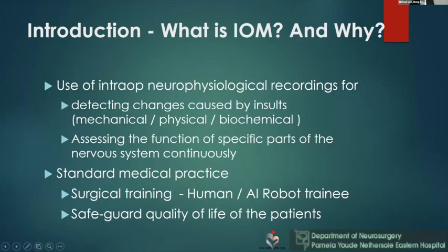So what is IOM and why do we do IOM? We use it for detecting changes caused by insults. It can be mechanical, physical, or biochemical, such as brain retraction, where you may have mechanical insults.